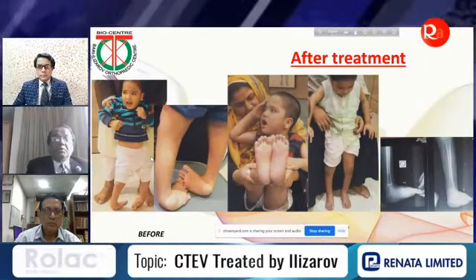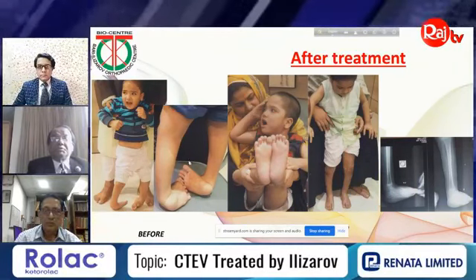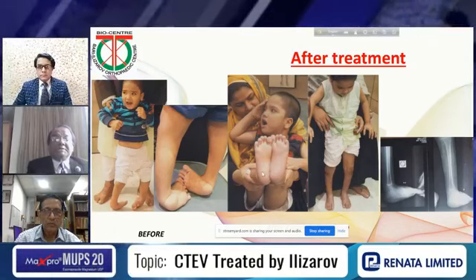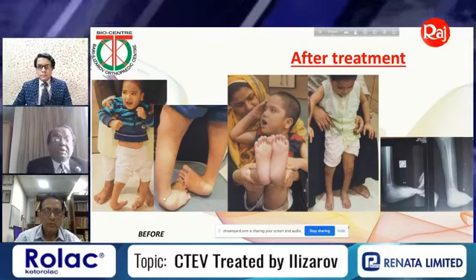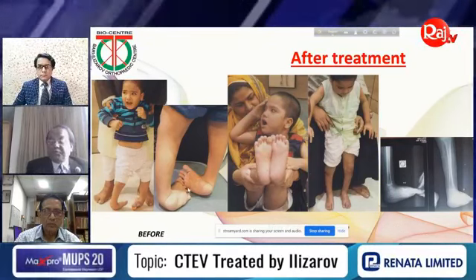After treatment, look. This is for the backside. See the sole of the foot. So beautifully corrected. All contracted structures. And this is the normal situation. Now look at this, how the patient was standing with this club foot.